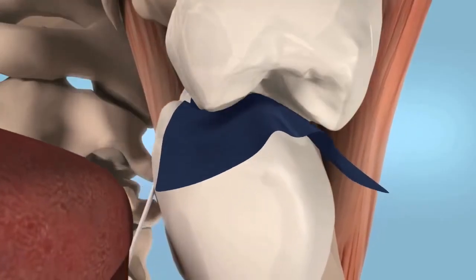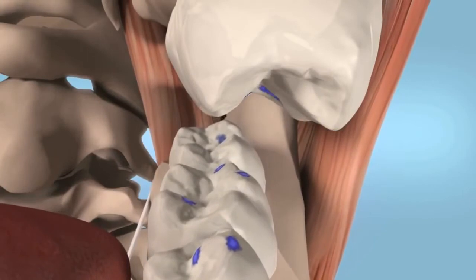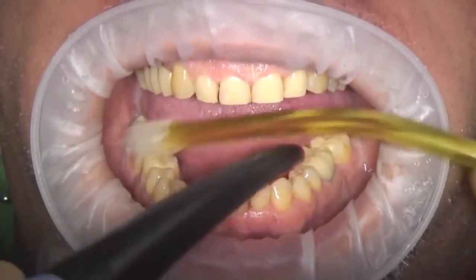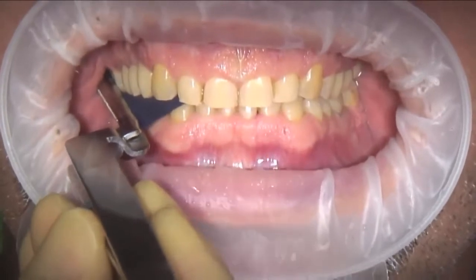The occlusal contact points, or centric contacts, are marked very precisely because of its progressive color transfer. This new addition to the Bausch line is a 100 micron thin paper which is impregnated with hydrophilic waxes and pharmaceutical oils.